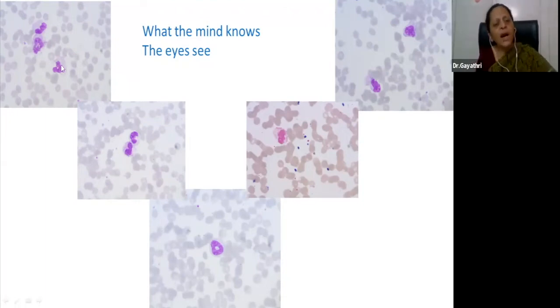So once you find it difficult to identify several granulocytic cells, you must brighten your vision to identify more abnormalities, and then you will be rewarded with something that could be fairly diagnostic, like this ring-shaped nucleus in a neutrophil.